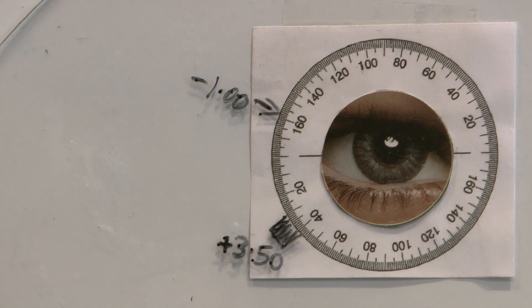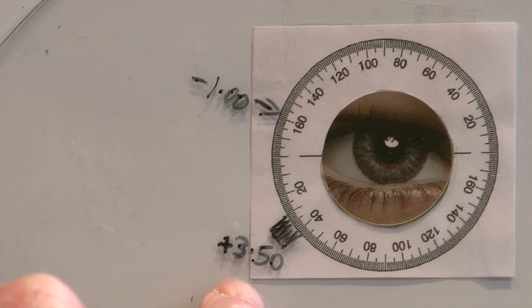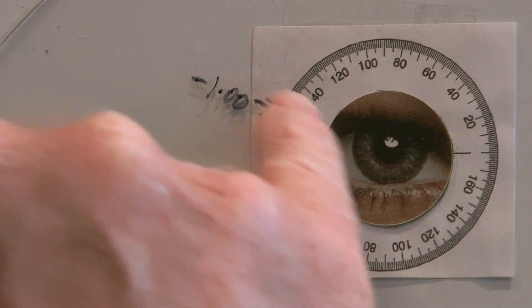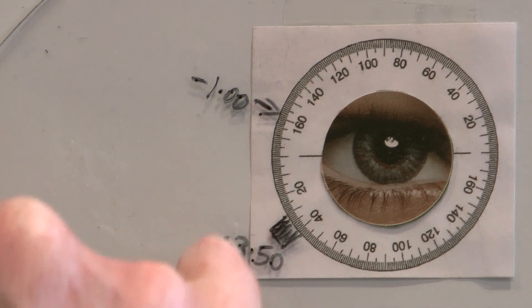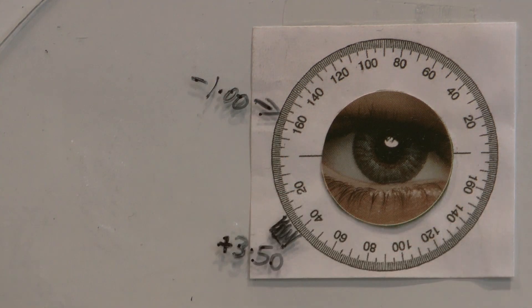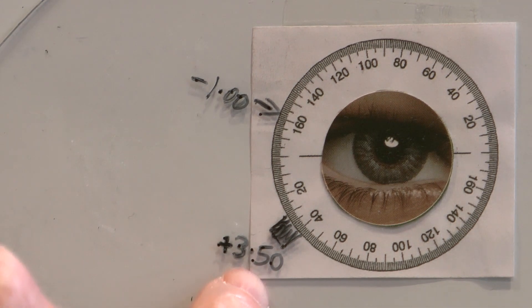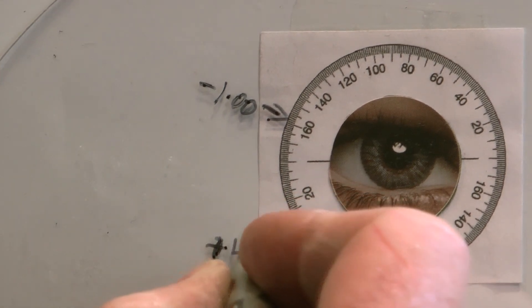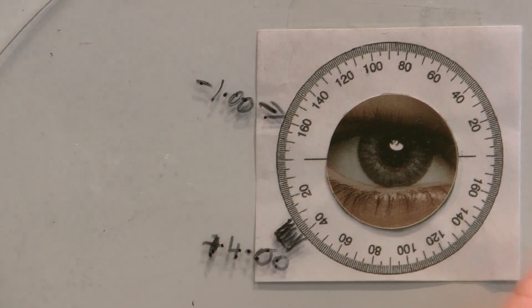Now there's a rule when doing cross cylinder: we have to add plus to the best vision sphere when we increase the minus power of the cylinder. We always increase the plus sphere by half of the amount we increase the minus cylinder. So we increased the minus to minus 1.00, therefore we add 0.50 to the sphere, which becomes plus 4.00. At the moment we've got plus 4.00, minus 1.00, axis 160.